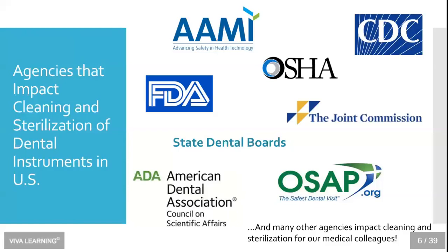I would like to point out from this the logo on the lower right-hand side, OSAP, Organization for Safety, Asepsis, and Prevention, and that is our one and only infection control organization dedicated exclusively to the practice of dentistry. So if you ever need any more resources with regard to instrument processing, I encourage you to look at OSAP. Now, all of these agencies have an impact of cleaning and sterilization in dentistry in the United States.